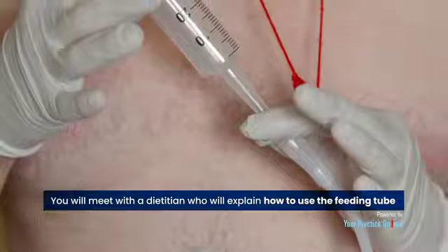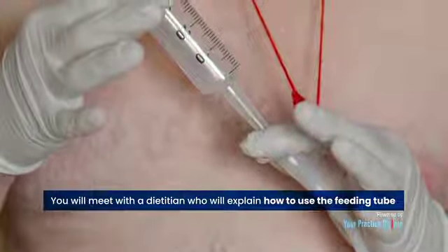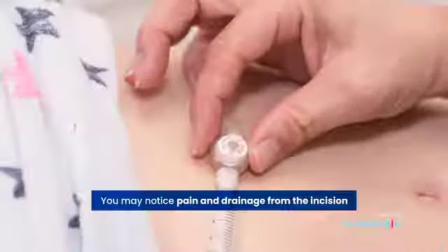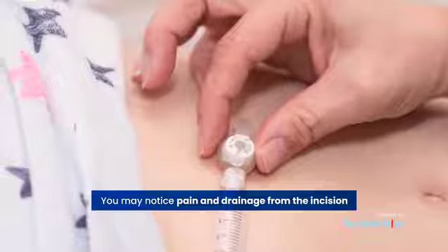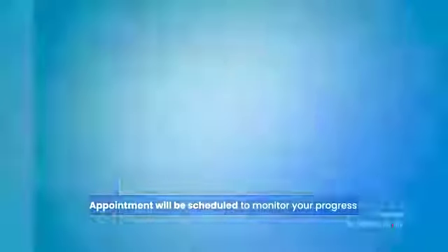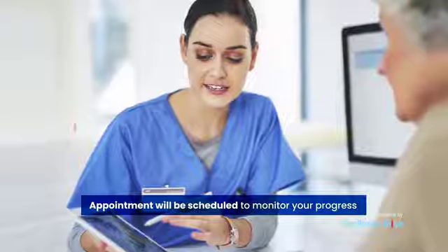After the area around your feeding tube heals, you will meet with a dietitian who will explain how to use the feeding tube. Feedings will start slowly with clear liquids and be advanced accordingly. You may notice pain and drainage from the incision site, or cramping from gas buildup in your digestive system. Medications are provided as needed to address these. A follow-up appointment will be scheduled to monitor your progress.